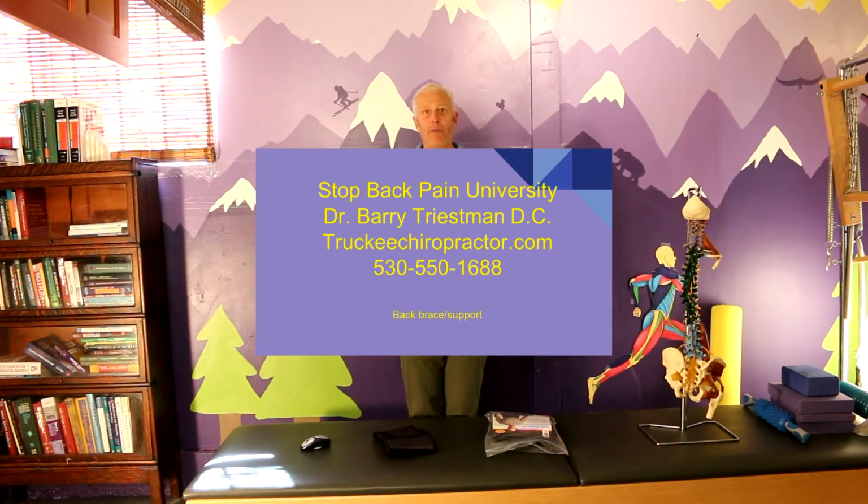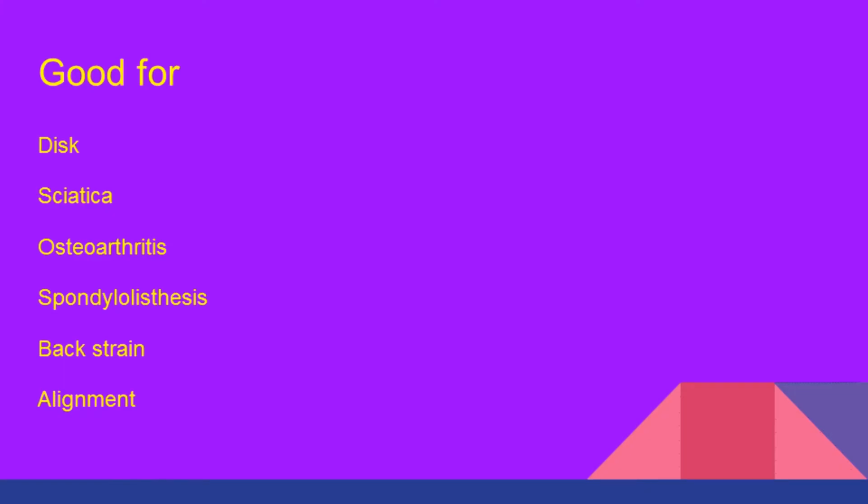So we're going to talk about back braces, and you'll be able to make a better, more informed decision about what and how to use a back brace, and where it's applicable, where it's not applicable. Back braces are going to be good for problems like disc, sciatica, osteoarthritis, spondylolisthesis, back strains, and generalized alignment.